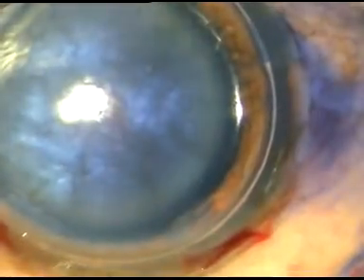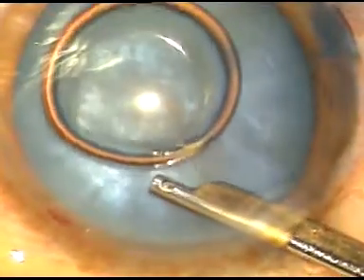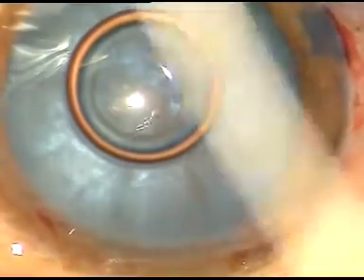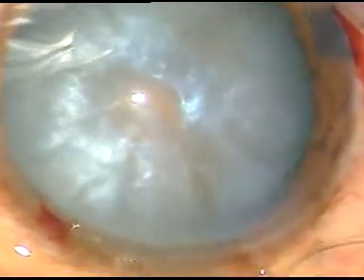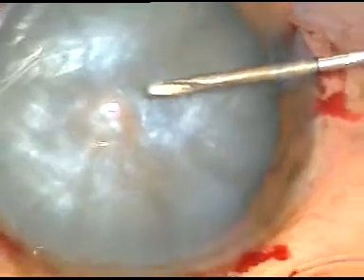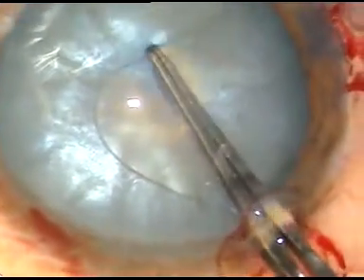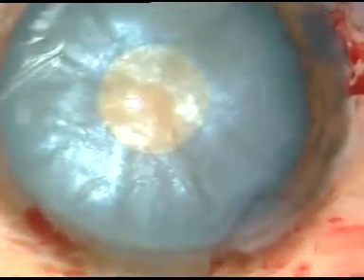Beginners can make a side port, stain with the dye, inject visco through the side port, and then make the main incision. After making the main incision, you puncture and incise the anterior capsule at the anterior pole of the cataractous lens. Moderate amount of milky fluid comes out, indicating that in this case the intralenticular pressure was raised moderately.